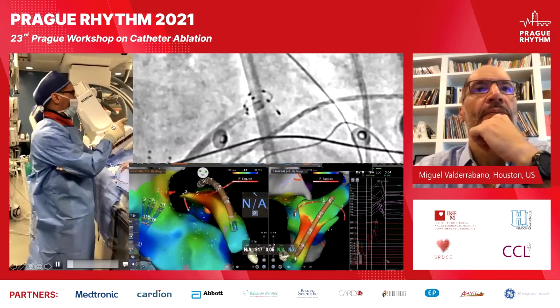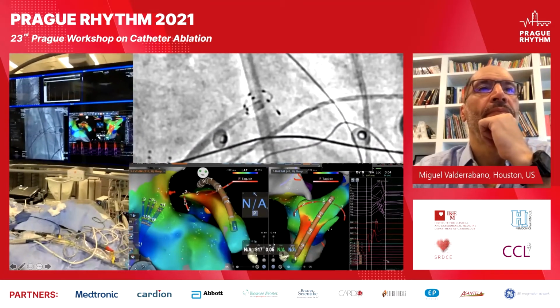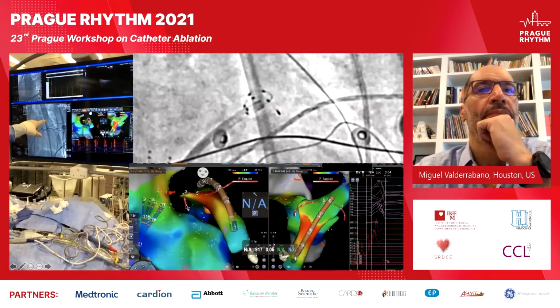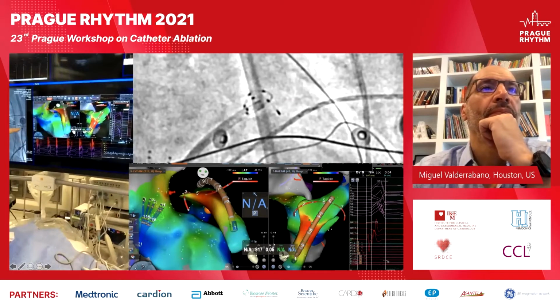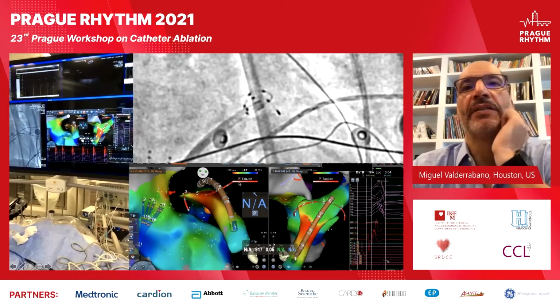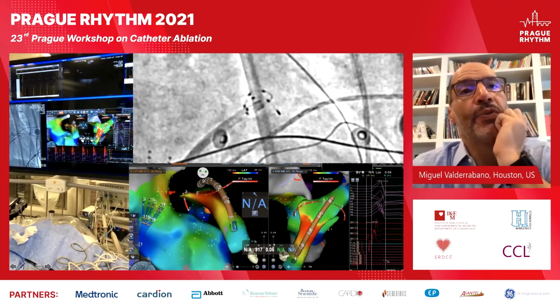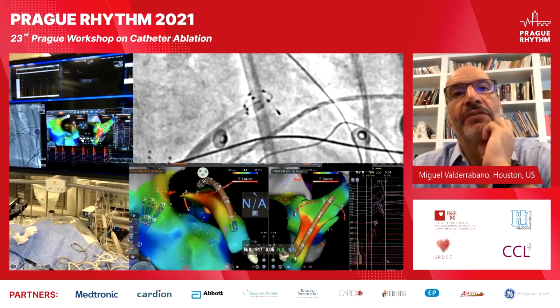We just found one very early septal branch that, as you can see there, is between the left main and the AIV, and it goes deep intramural there between the LV outflow tract and the AIV. You can see here, this was just by maneuvering the octopolar catheter, we got into an earlier branch. The signal here preceded the QRS by 44 milliseconds. So this is much better.